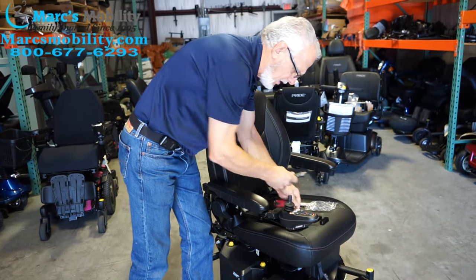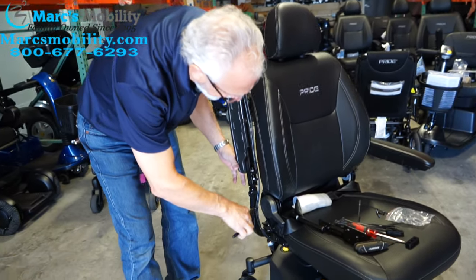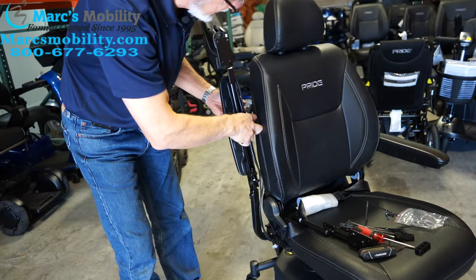The first thing you will do is raise your arm up and cut the little ties right here. There's one there and there's another one here, so the cable is loose.